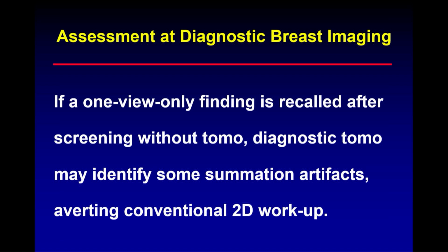Now, if a one-view finding was done without tomo, then another thing is, instead of doing the two pictures, you can just get a tomo in the same projection because it wasn't done at screening. Many radiologists have practices where some but not all patients have tomo. Actually, the majority of radiologists who have tomo do not use it on all screening patients. We try at UCSF to use it on all screening patients, but still 10 or 15% of our patients don't want tomo. They say, I don't want it, so we don't do it.